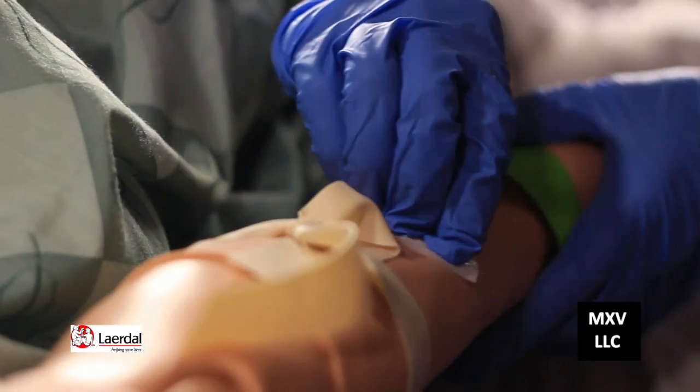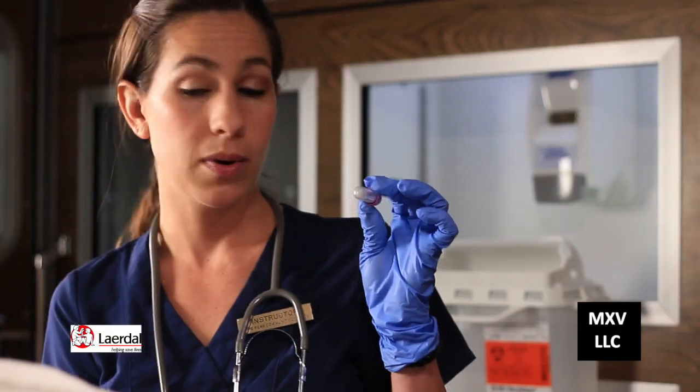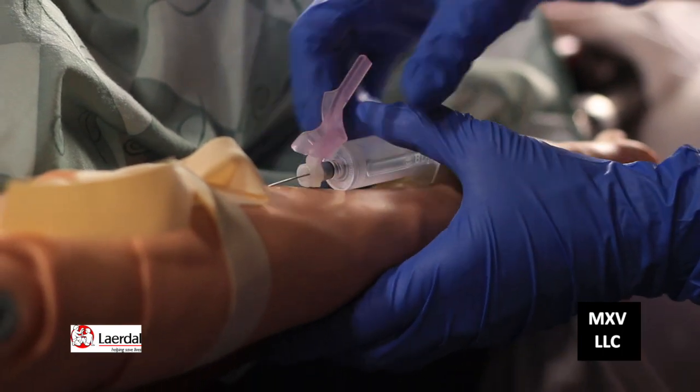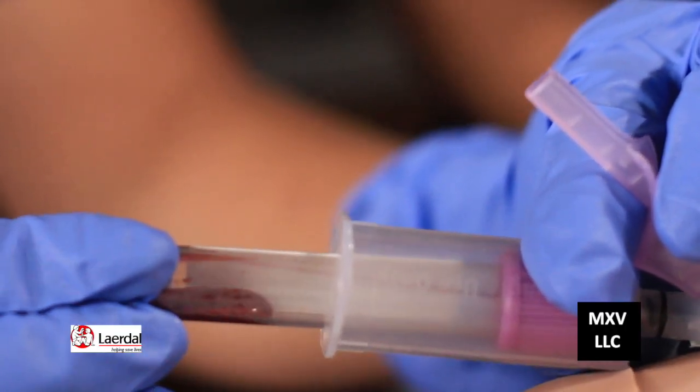Usually I feel around. Go ahead and take the alcohol and clean the site where you're going to be drawing blood from. Now we've got our needle. This is the vacutainer holder, and this is the vacutainer where we're going to be collecting the blood. So you feel for the vein, tell the patient that you're about to stick them, and you go in at about a 45 degree angle, then as soon as you get in there, go back down. Grab your vacutainer tube, stick it in, and we've got the blood.